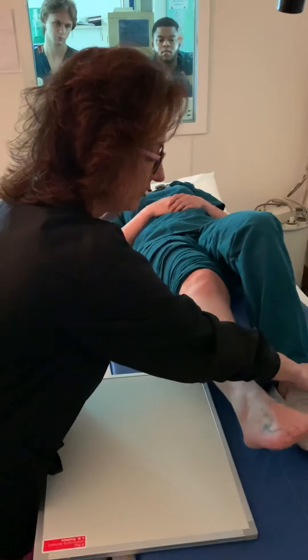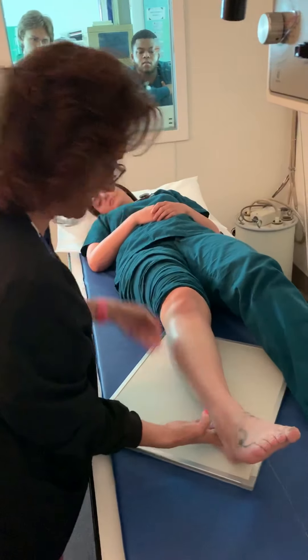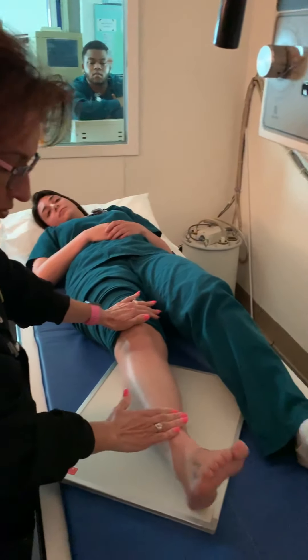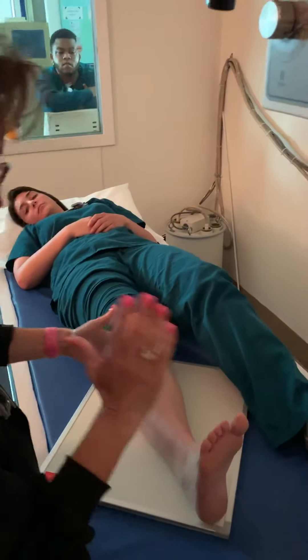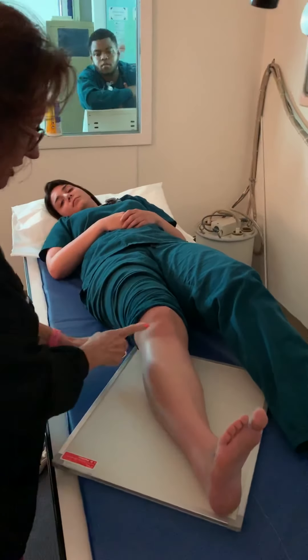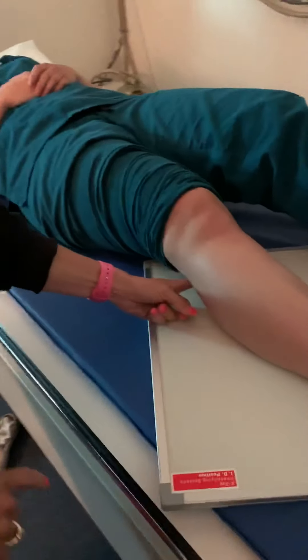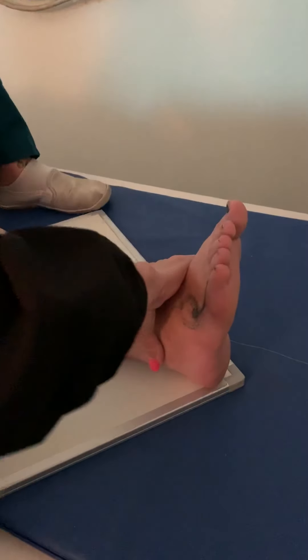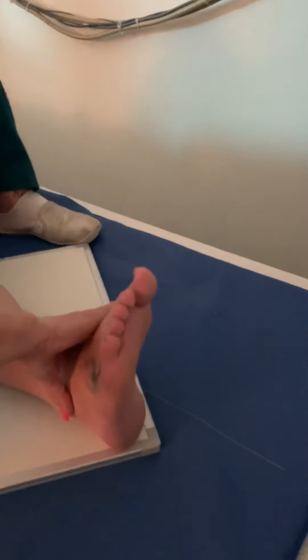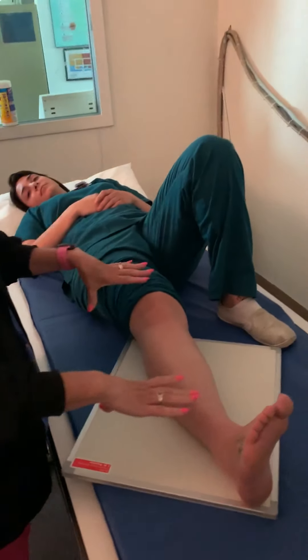We'll move that leg over just a little bit and lift that up. Bring your toes back towards you — dorsiflex the foot, just so that it's straight up and down. You want to make sure you have the knee; usually I check where the bend of the knee is. You want to make sure you have that on the IR and also have the medial and lateral malleolus on the IR. She has plenty of room top and bottom, so she fits perfectly.